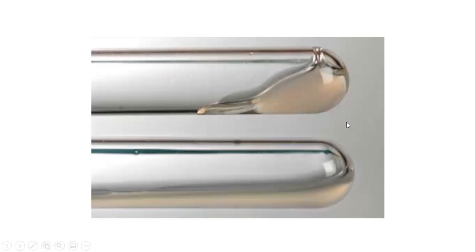Right, so you have there two test tubes. The test tube on top is the one that shows a successful clot formation, so basically a successful APTT procedure.